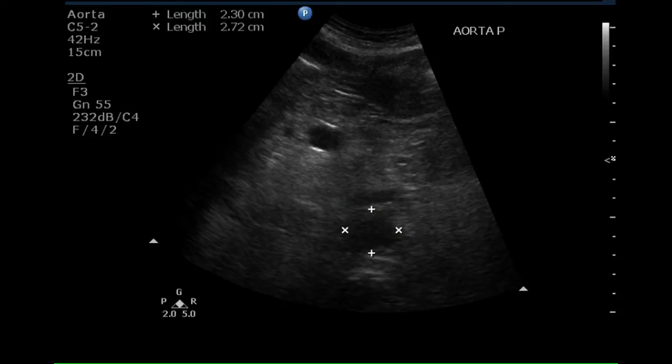Ultrasound examination was performed to rule out abdominal aortic aneurysm. This is a transverse image at the proximal portion of the aorta. The diameter of this vessel is normal.